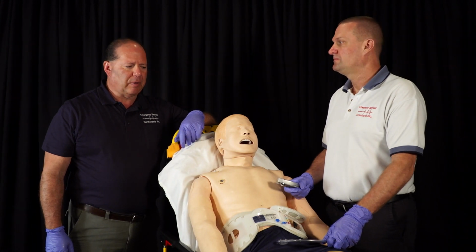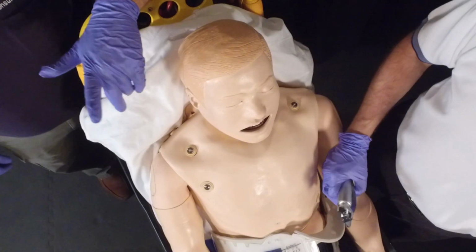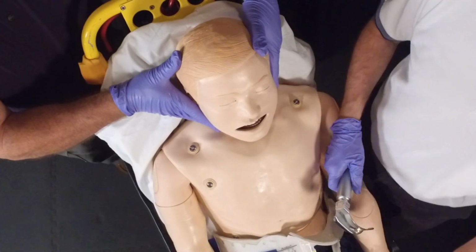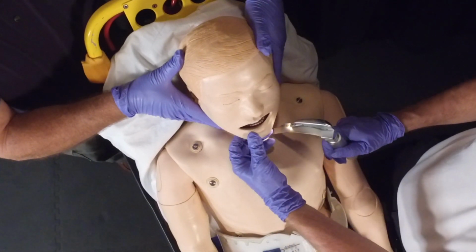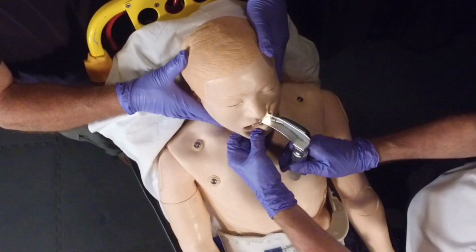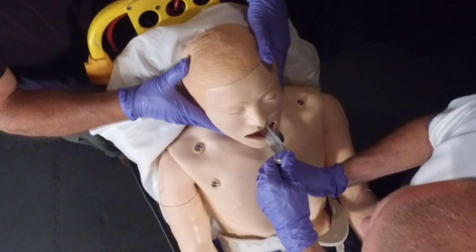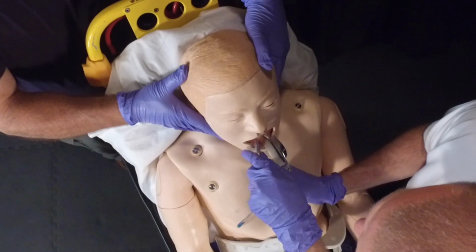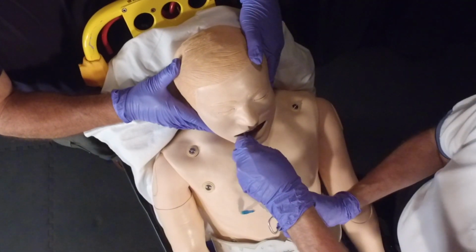Frequently takes two people. If we were considering this patient to have a spinal injury, we would put a collar on his neck. But one person would hold the patient's head in the neutral or airway open position based on what we were trying to do. The intubator has to put the blade in his right hand, finds the vallecula, and then pulls forward to see the glottic opening. The left hand then places the tube. So this is the opposite hands of what you would normally intubate with.